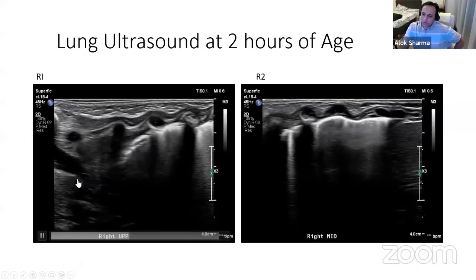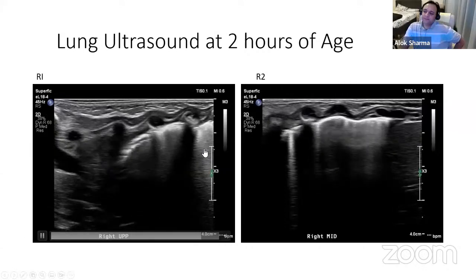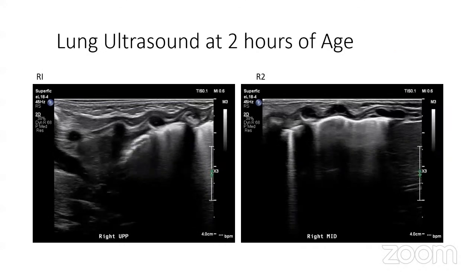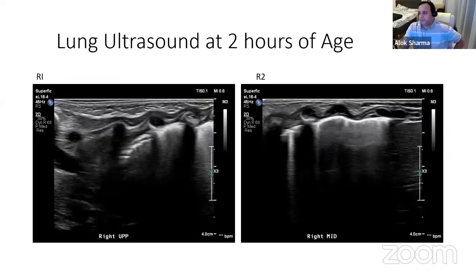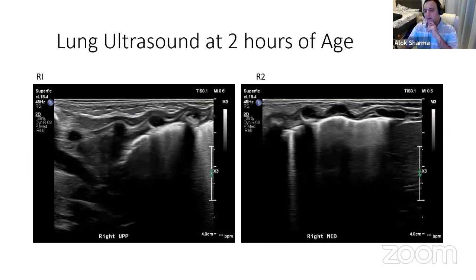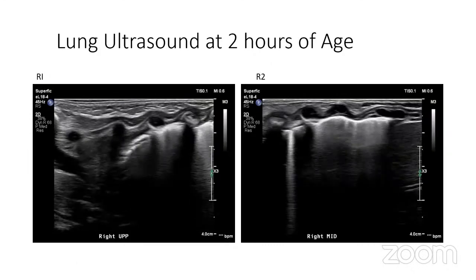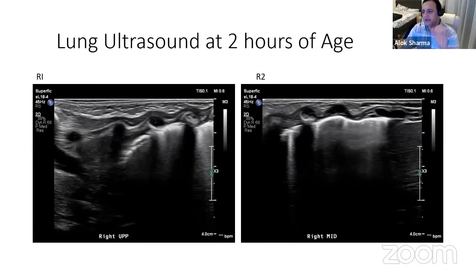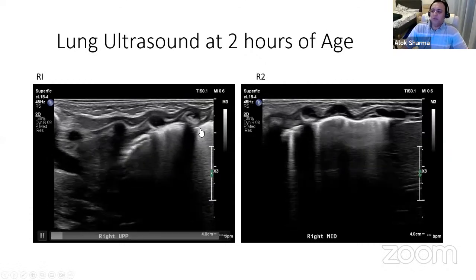Suman, you want to say something? Yes, towards the extreme right in that same image the pleura looks a little less sliding and there are B lines there. Very good. So is there a lung point there? No. A lung point, Suman, is seen only when you see a pneumothorax. You say double lung point, that's fine, but be very careful of the connotations you're using. Double lung point is used in the context of a sharp interface. What I'd say is you've got pleura that looks very irregular.